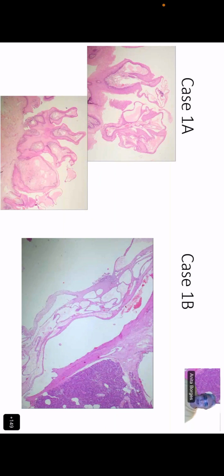When we make an observation, here we have this squamous epithelium growing in an exophytic way, and there are cystically dilated spaces that are filling that stroma, and you put two and two together, and your interpretation is that this is not a papilla. Do you get me, Dia? Yes, ma'am. Does it make sense to all four of you?